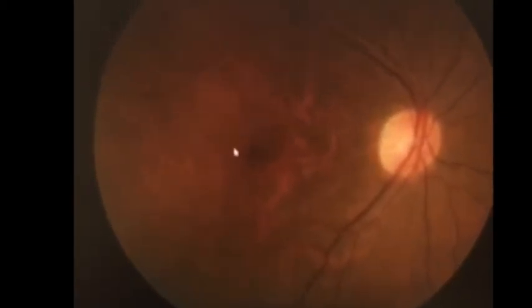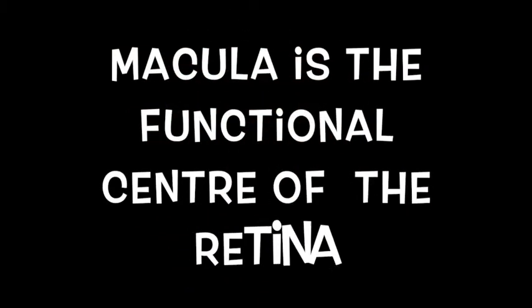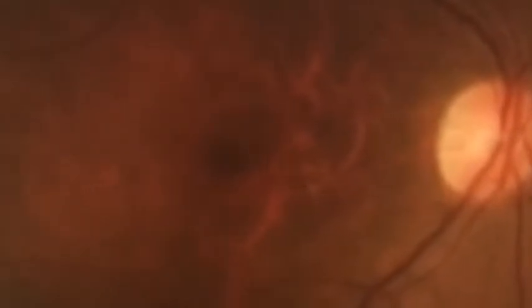Also, you can see there's a darker patch in the middle here. This patch is called the macula. It's for your central vision, and this is a really important part of the back of the eye. When you look straight at something, that's where all the light focuses on the back of the eye. Therefore, it's very important to wear sunglasses because it protects this area from UV damage over the years. So you tend to find people that have lived abroad or that are out in the sunlight or go in sunbeds a lot without eye protection, you will find there will be changes in this area.